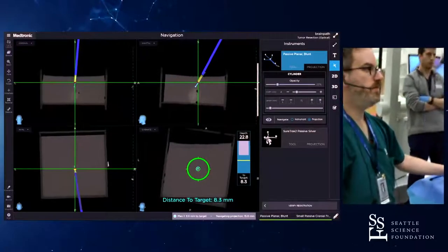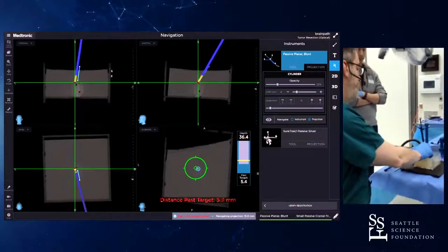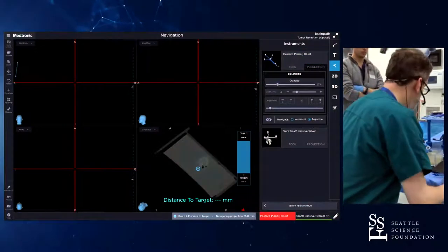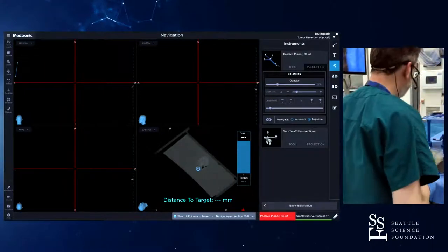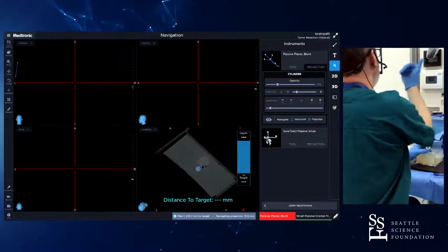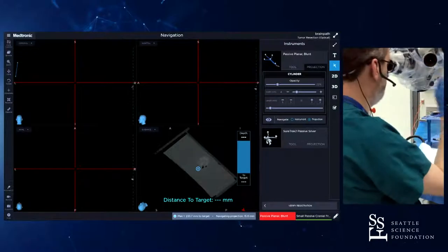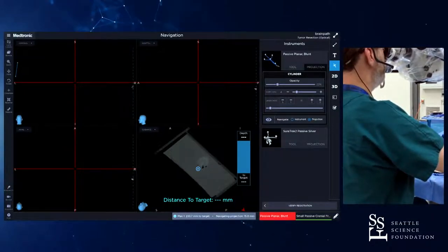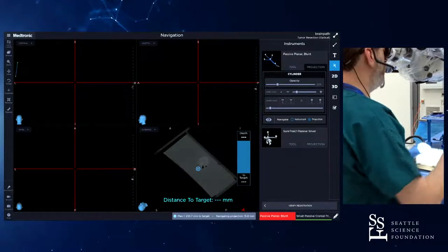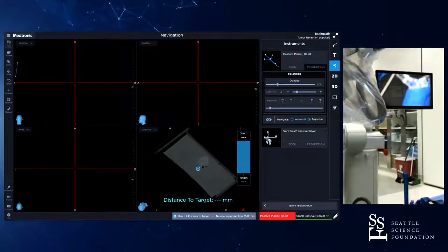Similar view — it looks just like I'm doing a needle biopsy. It says I'm past target, so that would be where I'd start to advance the port and retract the trocar. There's your port view, and here's the real-time tracking. As I move, it just moves with me — not that big a deal.